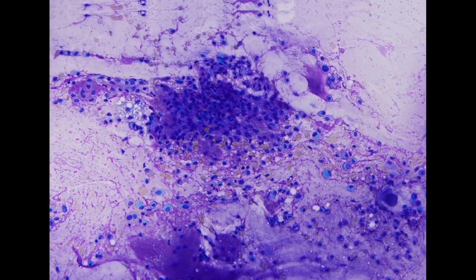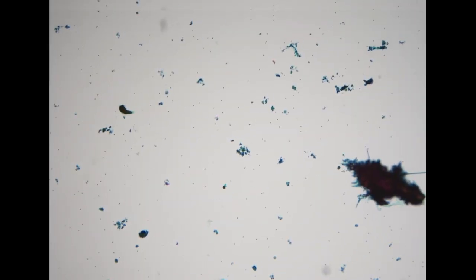For the diagnosis of benign pleomorphic adenoma, I always remind people that we should look for any possibility of high-grade carcinoma cells in the background, because for a long-standing PA, there might be a chance to develop a carcinoma ex pleomorphic adenoma. Occasionally we do see a few diagnostic specimens where we see pleomorphic adenoma and high-grade carcinoma, and we suggest it's CAXPA, and in the surgical excision it is a CAXPA.